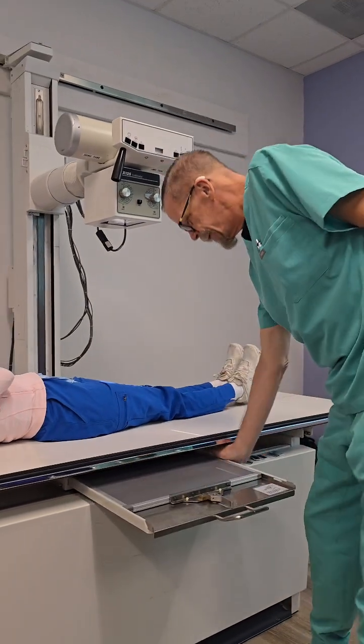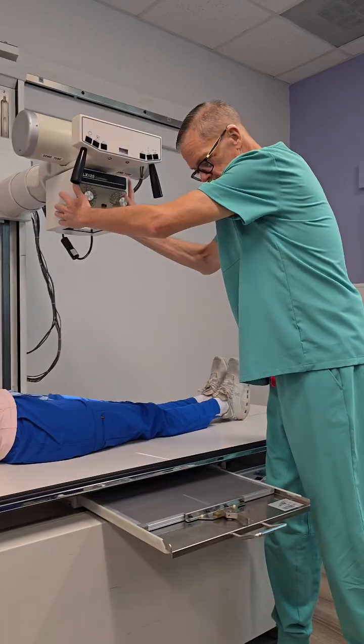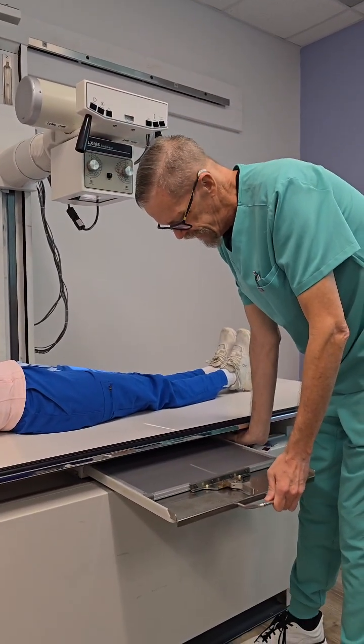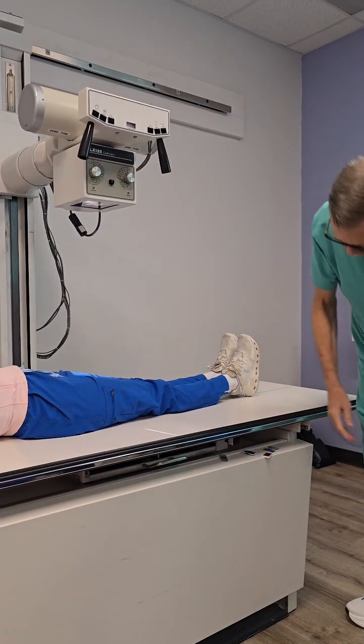Alright, so first thing — let's be sure that our CR and our IR are lined up. They are. We're going to be doing her right leg, her right femur.